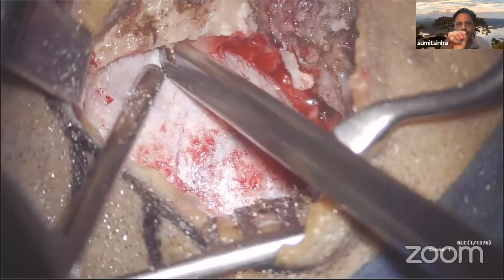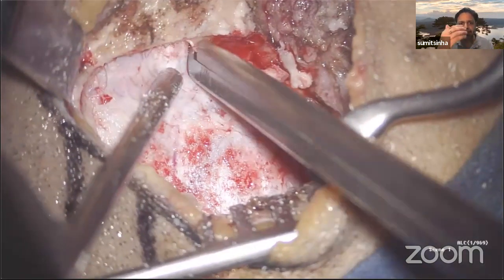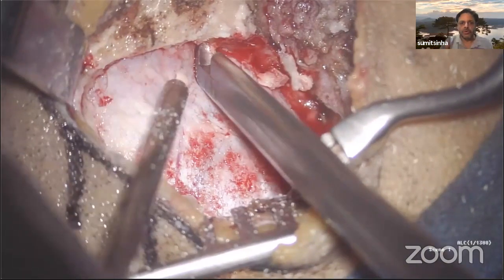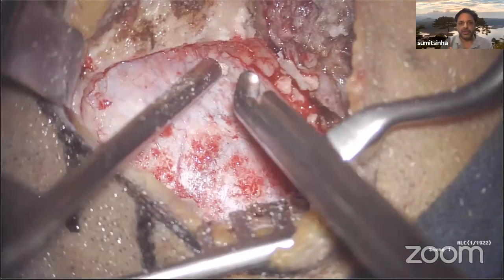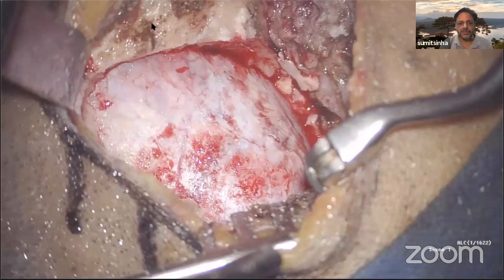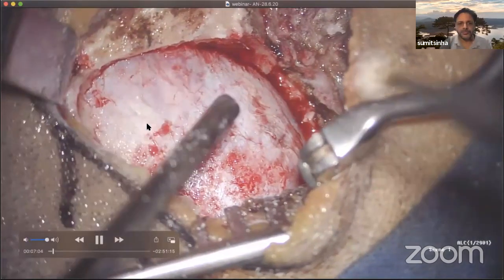Even a single millimeter of more drilling will help you in gaining an extra angle of vision, especially when you want to see more on the medial side. And it reduces the brain retraction also. Otherwise, you have to keep on struggling during the entire surgical procedure, and your vision will not be that good.